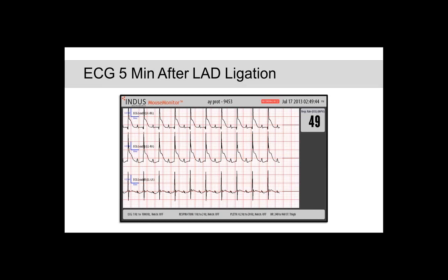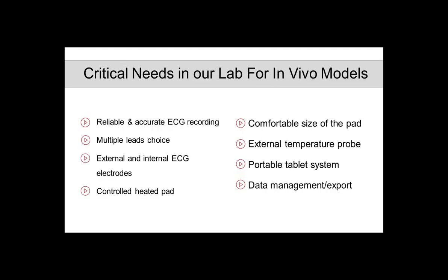Very similar to what you would see in humans, the mice in the permanently occluded model develop ST segment elevation within minutes of the MI. So this monitor is a very nice way for us to document proof of MI. When you're tying the coronary artery of a mouse, it's very, very small, and sometimes it's a bit of a guess as to where you're tying off, so having the EKG to show yes, you got it or no, you didn't, is really helpful. Our surgeries typically take about 15 minutes, so it's not a prolonged anesthetic period, but having the mouse warm throughout that period is definitely beneficial.